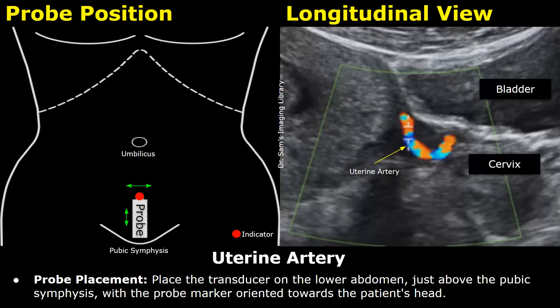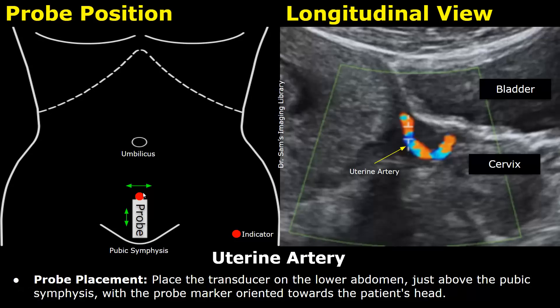This is a transabdominal approach. The transducer is placed on the lower abdomen just above the pubic symphysis, with the probe marker oriented towards the patient's head. This will give a longitudinal view of the uterus.